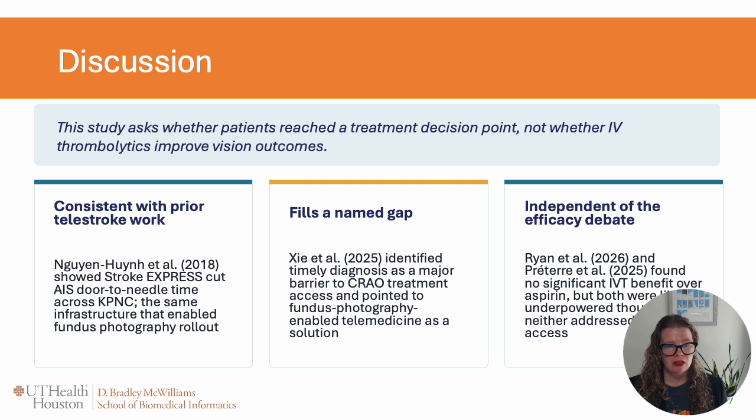The literature found that it's relatively difficult to achieve a timely diagnosis for central retinal artery occlusions. And the literature suggested that point of care fundus photography within the emergency department settings, coupled with telemedicine, could be a potential solution for diagnosis.